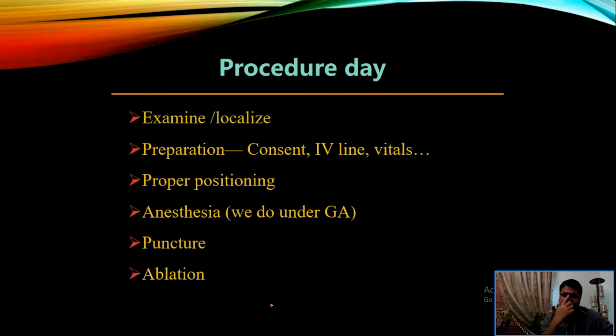Proper positioning is very important for needle incision, and especially we require an orthopedic drill for bone digging to reach the lesion, because, as we know, the surrounding bone is very thick and laminated, and it is very difficult to approach through a Jamshidi or some biopsy needle. So a few years back we started doing this procedure with an orthopedic drill, which is easier, more convenient and accurate. And then we plan for ablation.